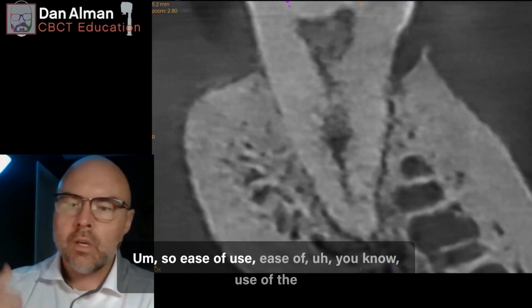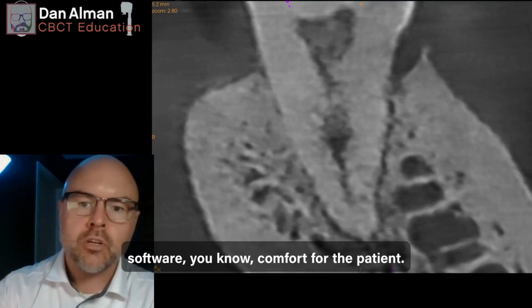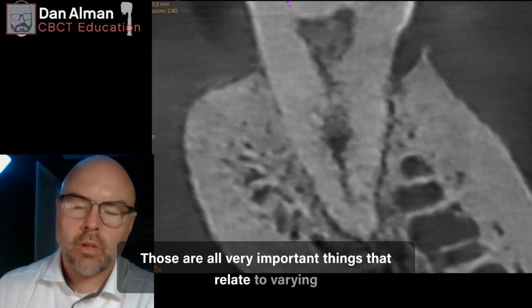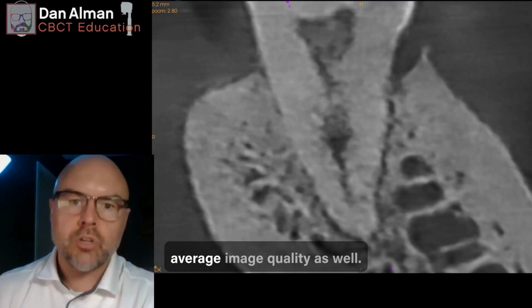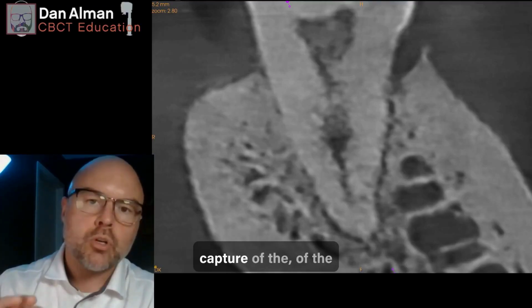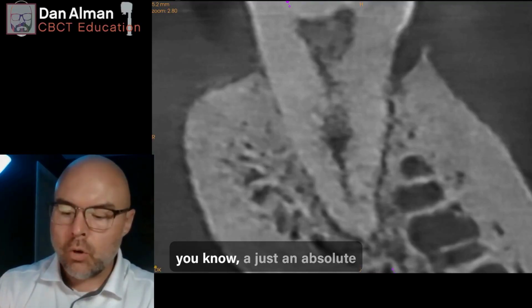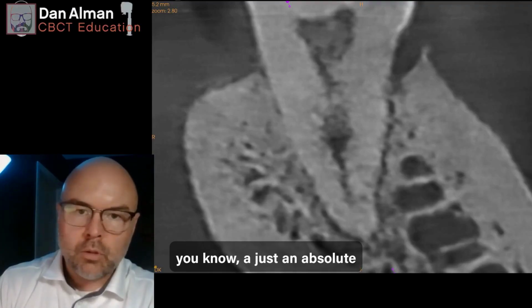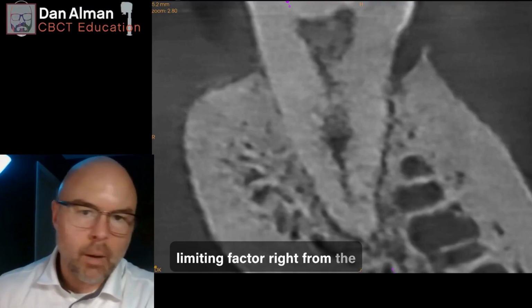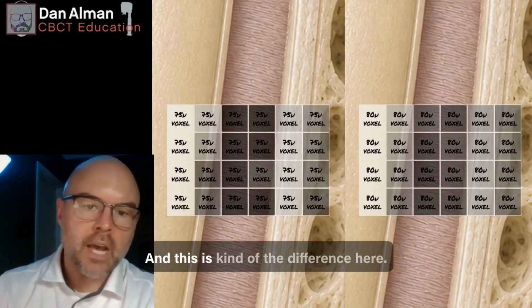So ease of use of the software, comfort for the patient. Those are all very important things that relate to varying average image quality as well. But the actual capture of the information from the start is an absolute limiting factor right from the beginning. So it's worth paying attention to. And this is kind of the difference here.